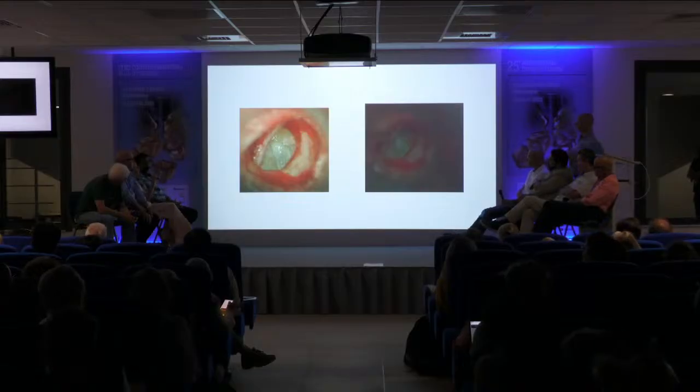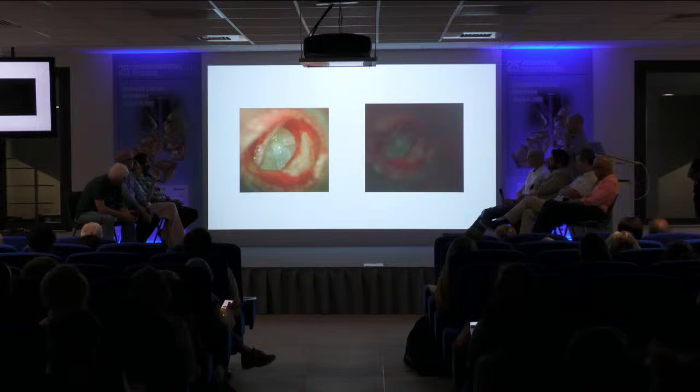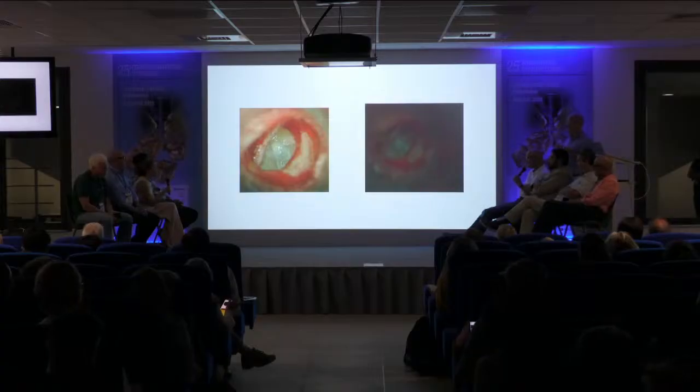A TORP. Yes. And does that TORP go to the malleus or does it go to the drum? To the eardrum with cartilage. Drum. And which TORP do you use? The Grace Medical. Okay. HA Light, is that? That's the one with the hydroxyapatite head.